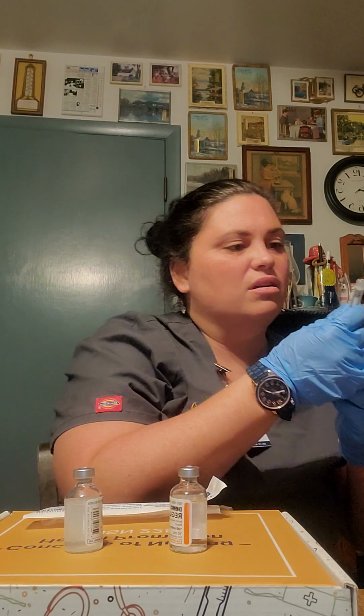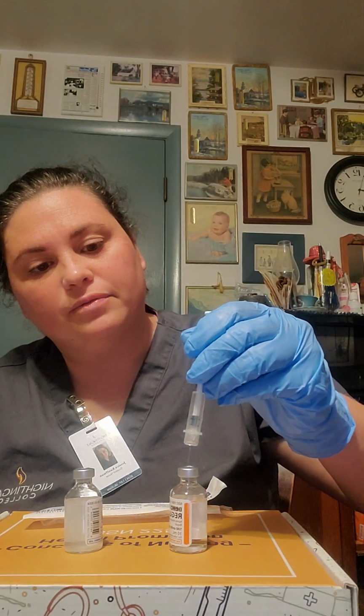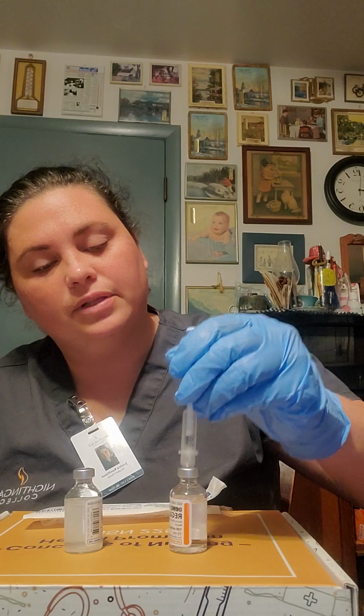Alright, I then am going to do a check with my nurse once I draw up, after I inject my 4 units of regular insulin. So I'm going to, with air, alright, so there's the 5 units, I'm going to go to 4. I'm going to inject this one with air.